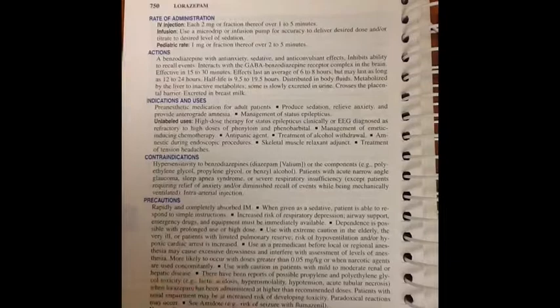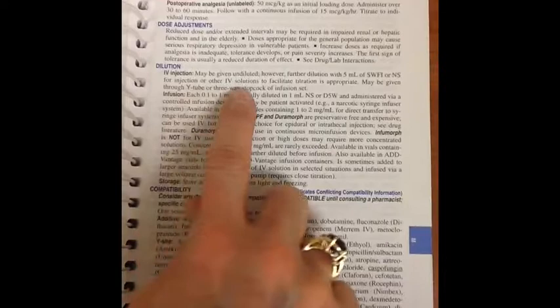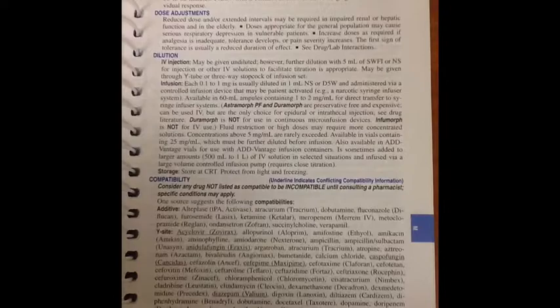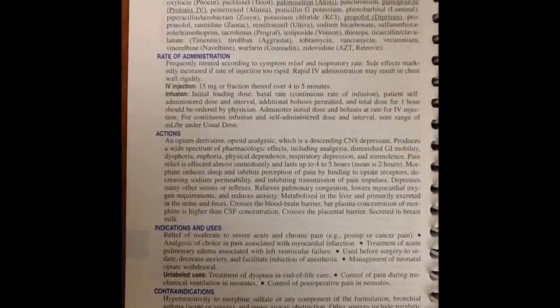Now I'm going to go over to morphine sulfate in the drug book. We're going to look at the dilution — it says may be given undiluted; however, for dilution, use 5 mils of sterile water, normal saline for injection, or other IV solutions. We are going to give it undiluted. Almost all drugs now are not diluted; there are only certain ones, and Ativan happens to be one that has to be diluted. The rate of administration is 15 milligrams or a fraction thereof over 4 to 5 minutes, so we have to give morphine over 4 to 5 minutes. Now we're going to gather our supplies.